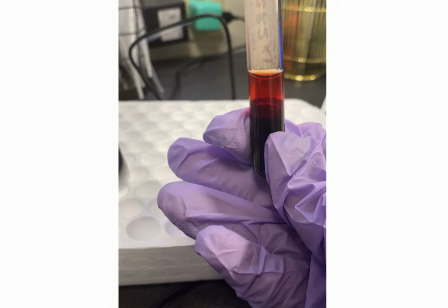In our example of warm autoantibody, the warm autoantibody should now be coating the reagent donor red cells, and the adsorbed plasma at the top will contain underlying alloantibodies if they exist. If the patient has no underlying alloantibodies, we'll see no reactivity in the adsorbed plasma because the warm autoantibody is now adsorbed onto the red cells.